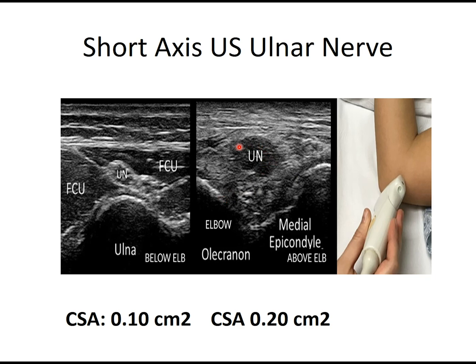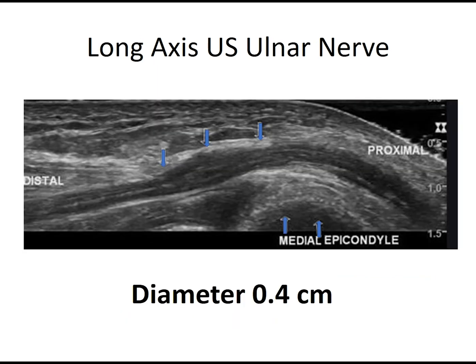And it's a lot larger — it's twice as big at 0.2 square centimeters. This is a long axis view which shows a significant change in morphology at the area of focal swelling, consistent with ulnar neuropathy, and that diameter of 0.4 centimeters is enlarged.